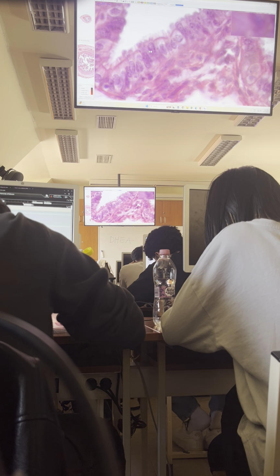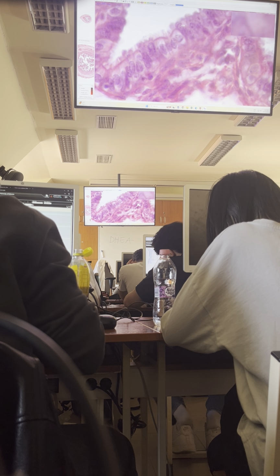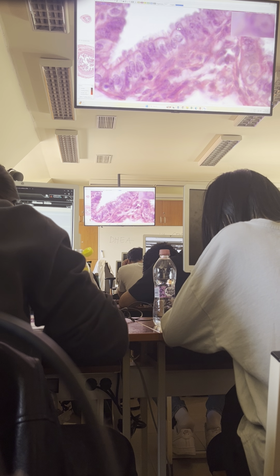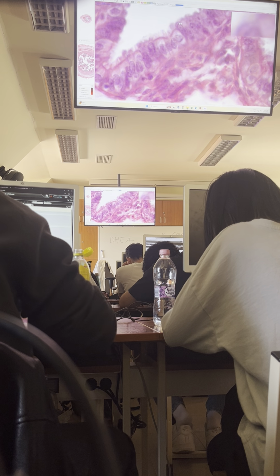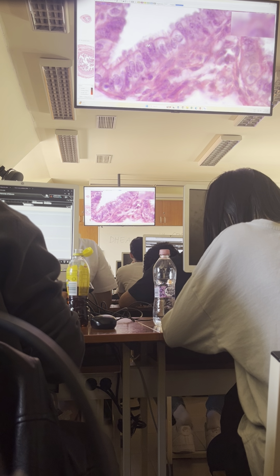But the difference relative to the previously seen estrogen-phased uterine tube is that now these secretory cells are taller than the ciliated cells. And they are bulging into the lumen. Okay, or here, or there.